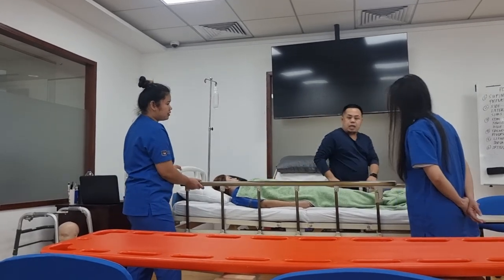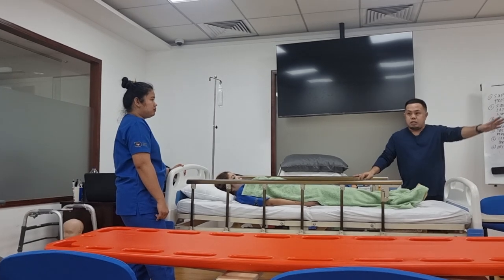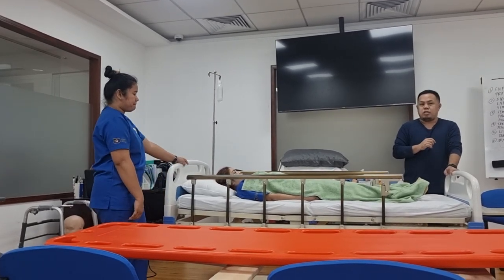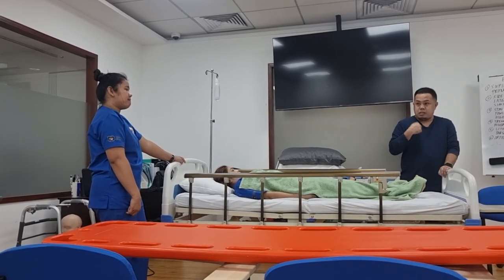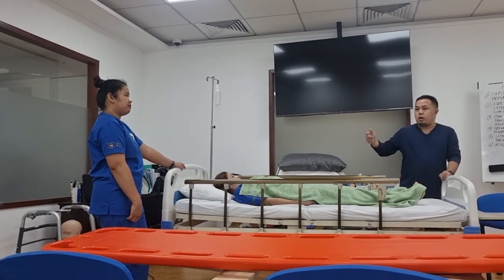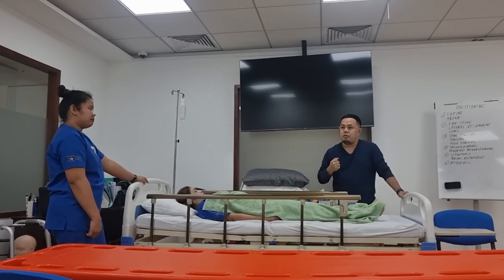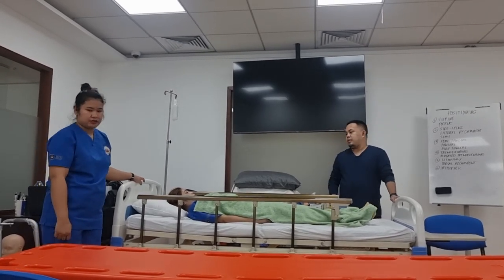Tell your colleagues: 'Let's go — we'll take the patient to the examination room.' We will endorse the patient to the examiner, then all go together back to the nurses' station, do hand washing, and do the documentation — because that's your patient. Then wait for the call from the examiner for you to take the patient back to the room. That's the end of the transfer.